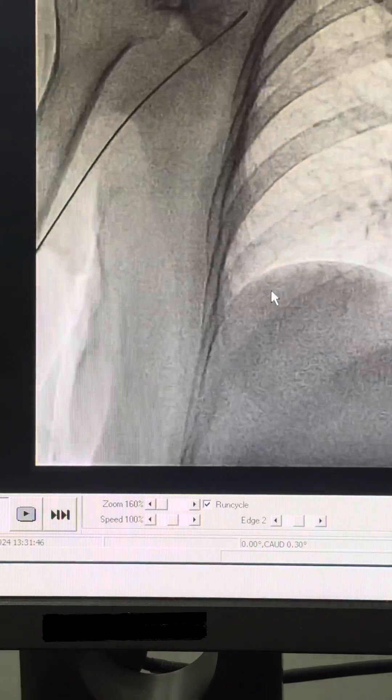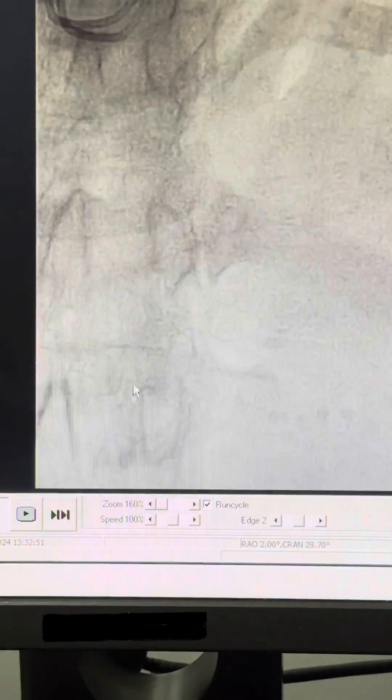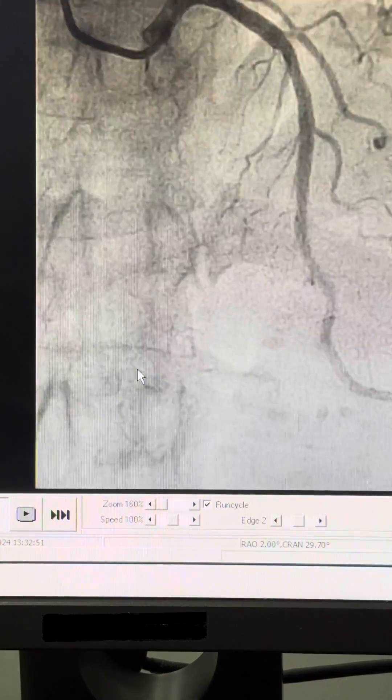After that, of course, you can advance the Opti-Torque catheter over the wire and then proceed with the coronary angiogram in the normal fashion.